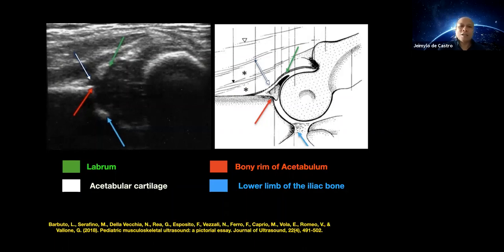So the direction of the leg is going sideways or diagonally to the right, okay? That is how it is oriented, so you will have a picture of what image you are looking at. Otherwise you cannot orient yourself, so at least you know exactly where it's going.